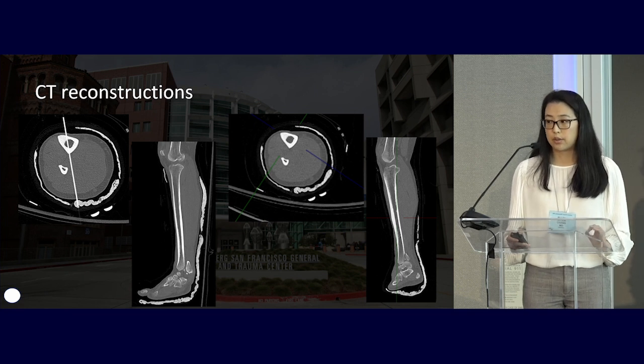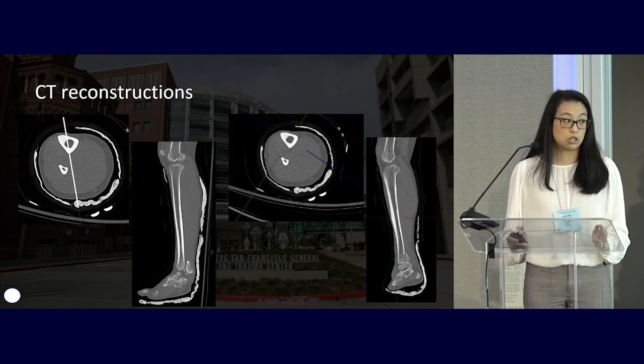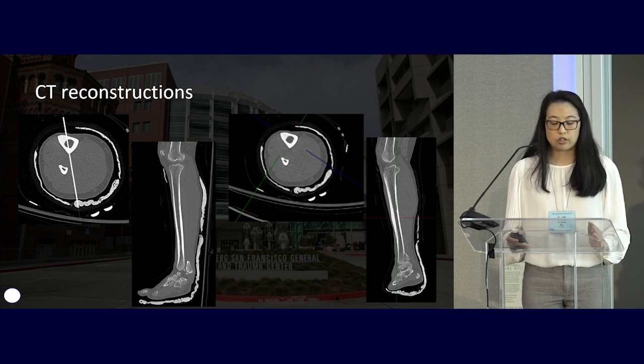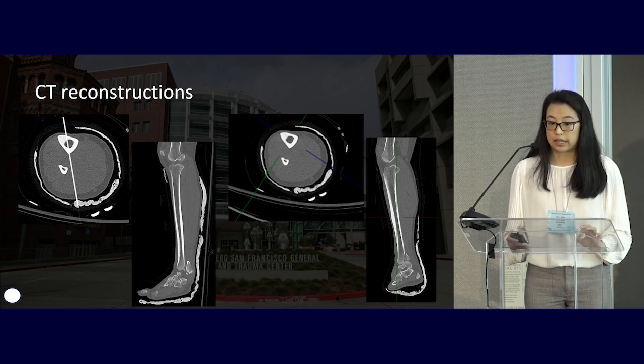And depending on how the patient is positioned within the scanner, the lower extremities are often externally rotated, the upper extremities may be placed on the body or in any number of different positions, and the automatic reconstructions will therefore not be orthogonal to the extremity or the area of concern. So for example, on the left here, you can see that the automatic sagittal reconstructions are not in the actual sagittal plane with respect to the calf, and so the subsequent sagittal reconstructions are off plane.